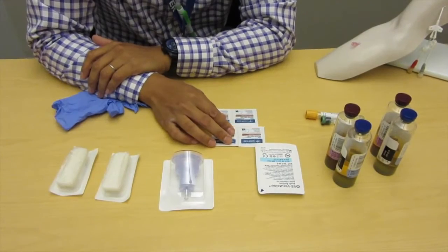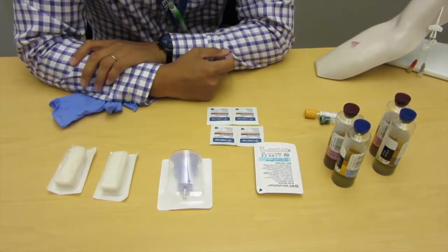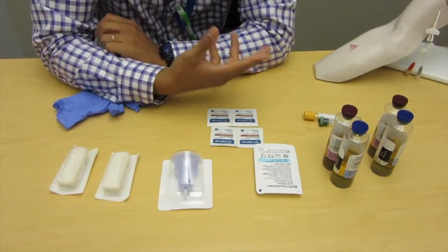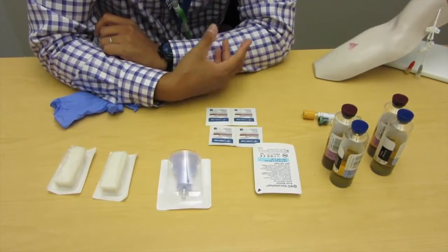I'm going to draw two sets of blood cultures. I'm going to use a fake arm over here. I'm not actually going to puncture this, but I want to go over the process and how to properly reduce our blood culture contamination rates.